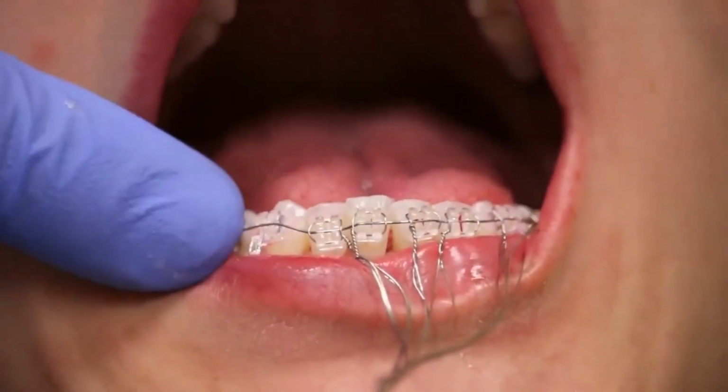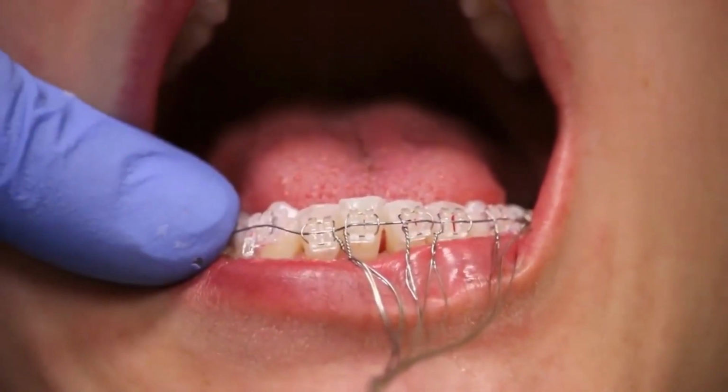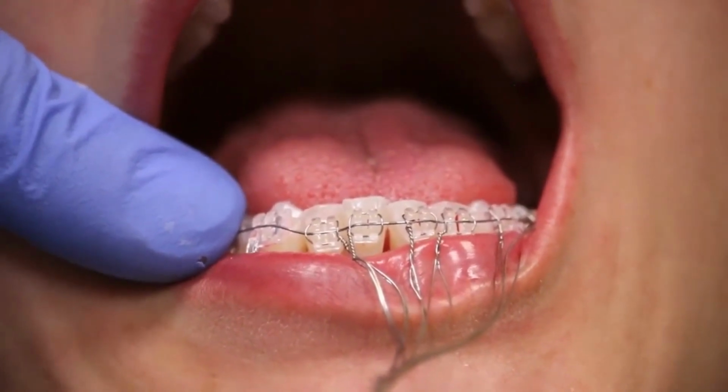Okay. That'll close her bite. That step will close her anterior open bite.